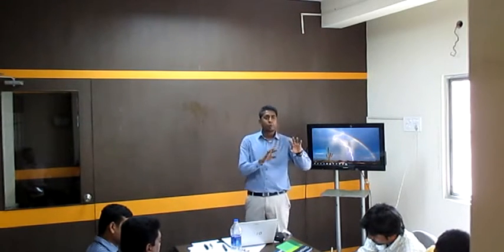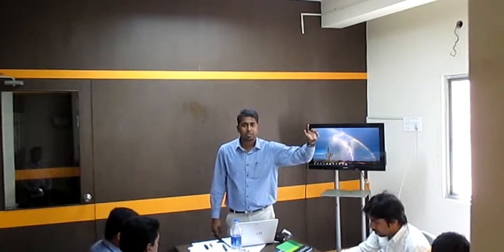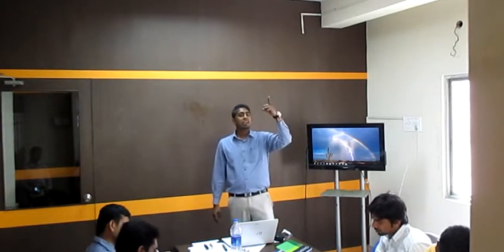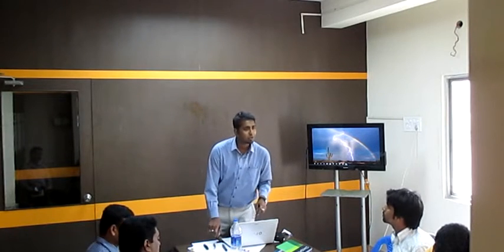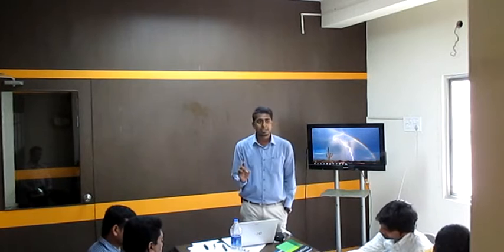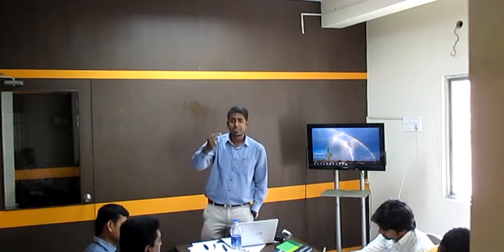Out of these 4, water and belt driven are a story of old days. They are out of the market. Nowadays only 2 are there: air driven and gear driven. Air driven are your air rotors and gear driven are your micromotor based handpieces. Got it? Just keep in mind, gear driven are micromotor based handpieces and air driven are air rotors.